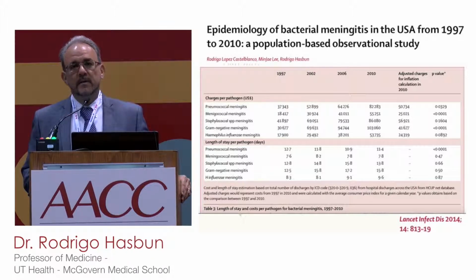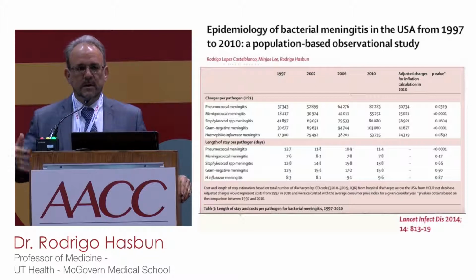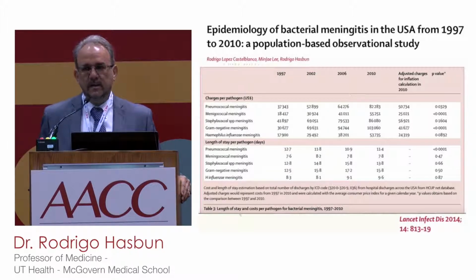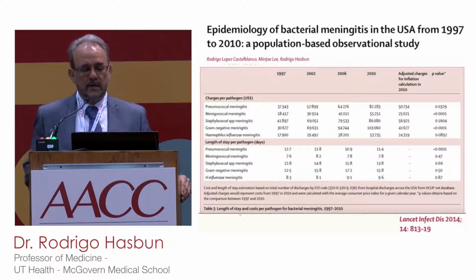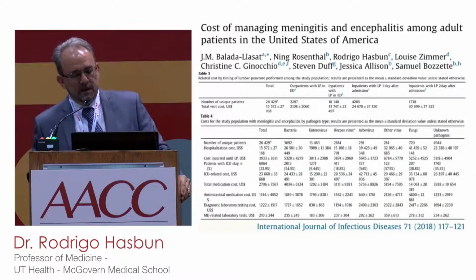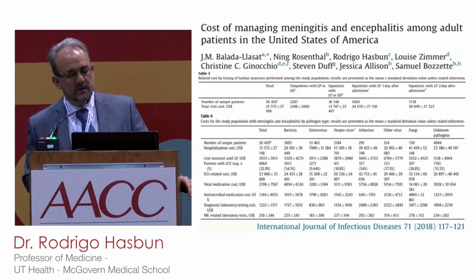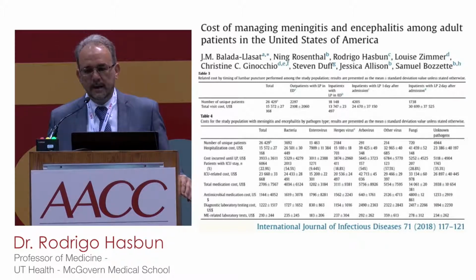That's bacterial meningitis. That we cannot really prevent them to be admitted. They need to be treated and they need to be in the hospital. But where we could save is not admitting those with viral meningitis. So here is a study we just published looking at cost of those 26,000 patients. What we can first see is that there's an increase in cost if you delay the LP.